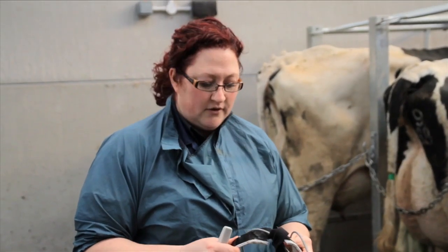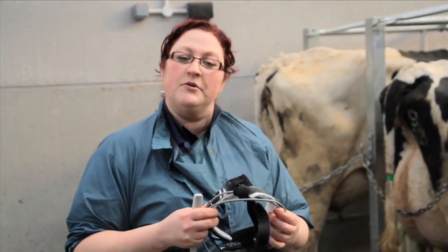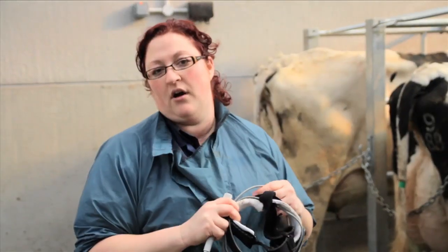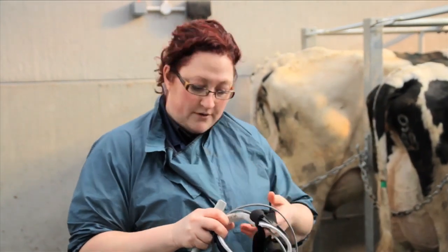As previously discussed, we do need to have some form of actually viewing the image. In this particular case, with this machine, what we'll be using is a set of goggles that actually shows us the image right before our eyes. So we'll just put those on now.